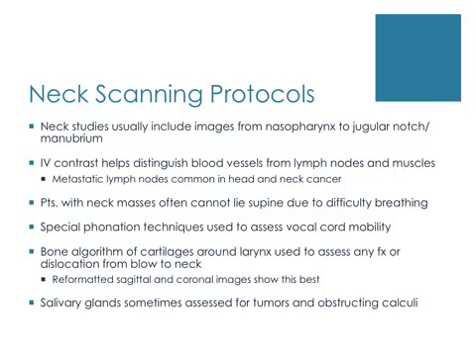IV contrast helps distinguish blood vessels from lymph nodes and muscles. Metastatic lymph nodes are common in head and neck cancer. Patients with neck masses often cannot lie supine due to difficulty breathing, and special phonation techniques are occasionally used to assess the mobility of the vocal cords.